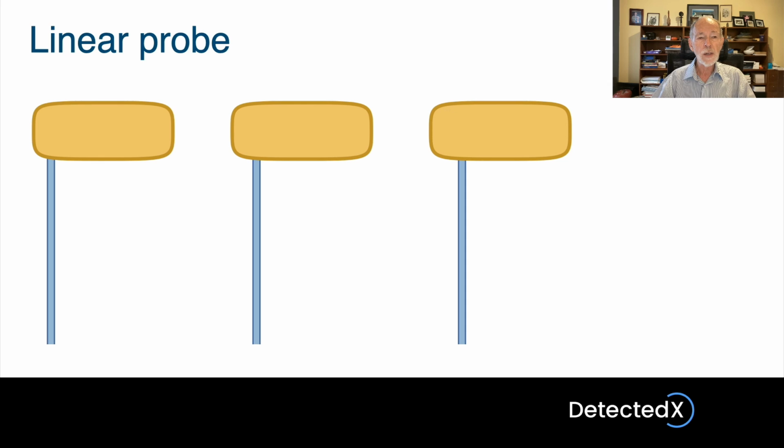It collects those echoes and places them in the image memory, which is where the image is being built up within the machine, and it remains stationary. So the beam remains in that position until all the echoes have been received from that particular beam position. The machine has then acquired one line of echo information to form the complete image.